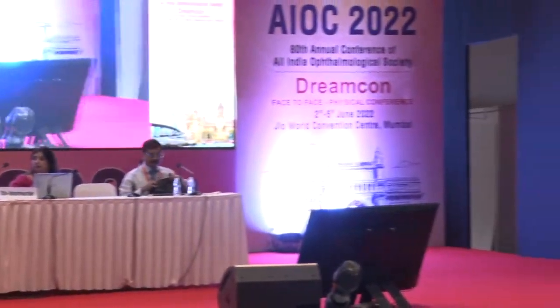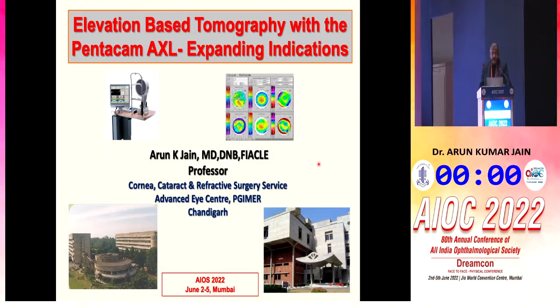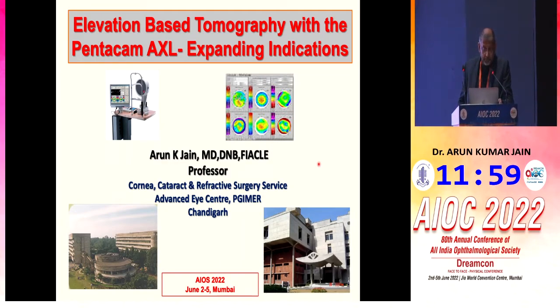So any questions from the panel or from the audience? We move on to the next talk, which is by Professor Arun Jain, and this is dealing with the corneal tomography with regard to the Pentacam AXL. Professor Jain, please. Thank you, Amit, for giving the opportunity and putting together this nice instruction course on diagnostics.